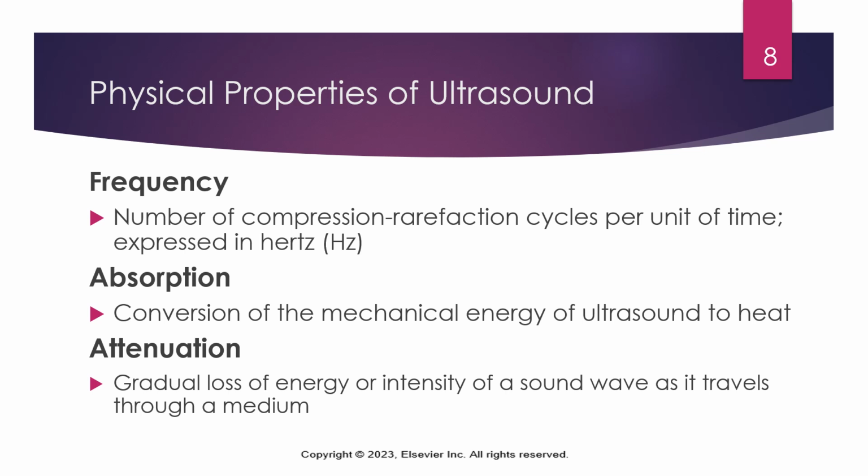Quite a few per second, obviously. When we hear the term absorption, this is something that refers to the conversion of mechanical energy of ultrasound to heat. So this is how the tissue converts ultrasound to that heat that we're talking about.